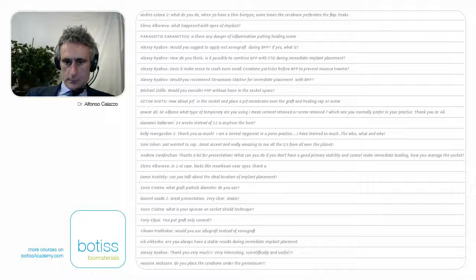The other question, again, is about the loss of the top of the alveolus. There is just a scattering in the CBCT, because if I had lost that much, I would see the tip of the implant coming through the soft tissue. And I think there are no more questions. Oh, here, there was another one.